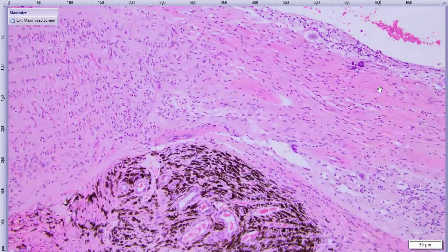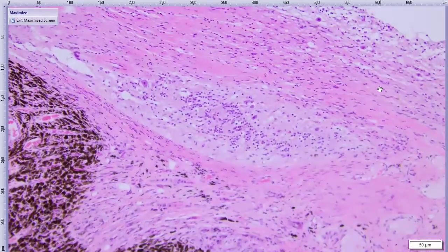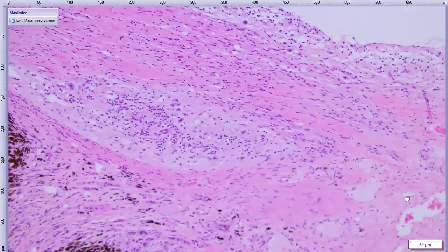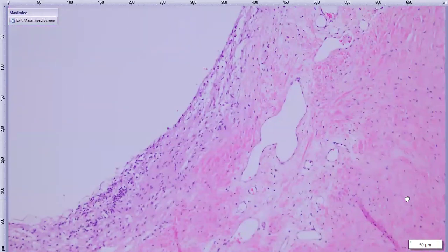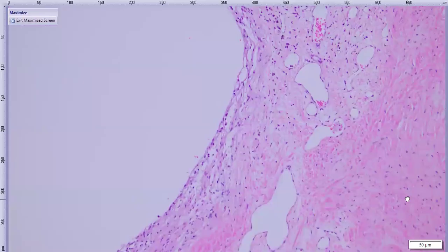And if we progress in, we can see that there is still retina. It's very jumbled, atrophied. You have a ganglion cell here, but otherwise the layers are pretty hard to distinguish. And it's embedded in this fibrosis that's inside the eye and detached. Here's some more of it extending that way. So that's this case.